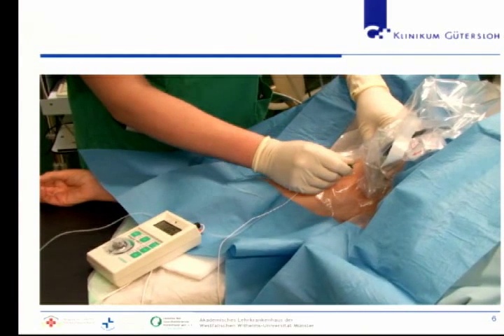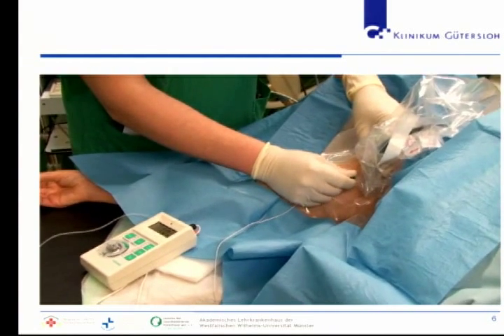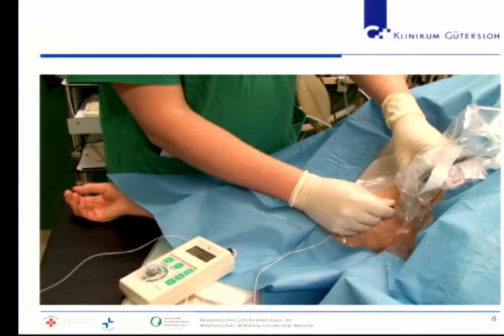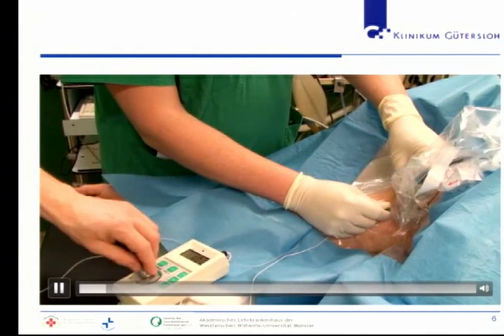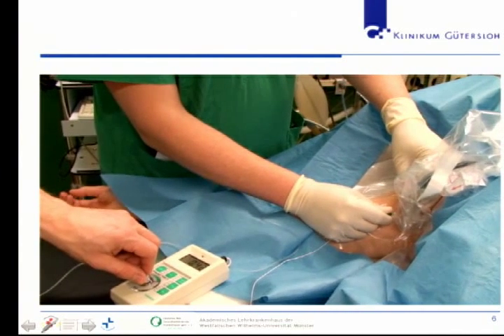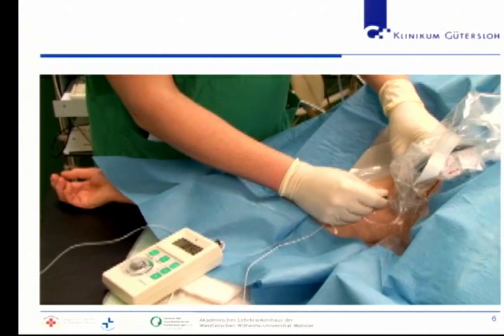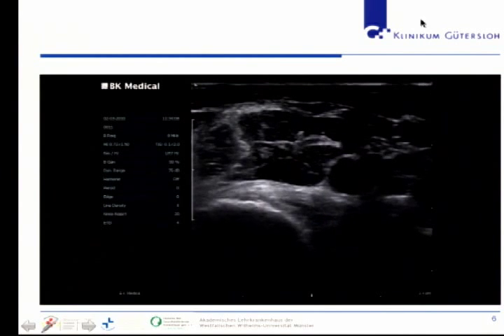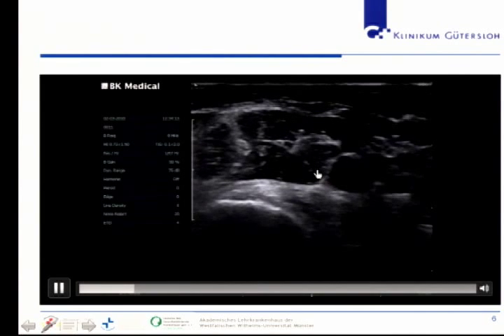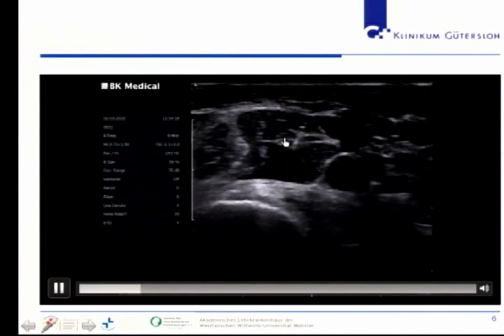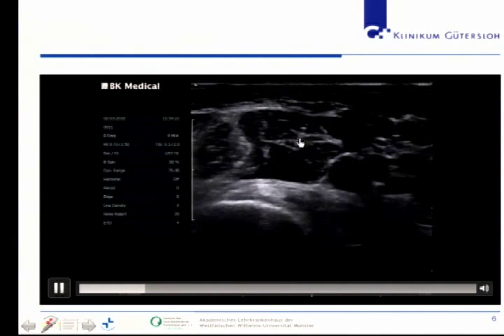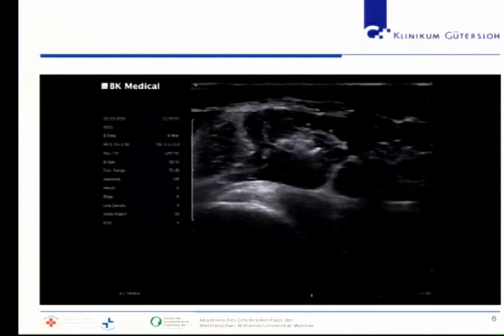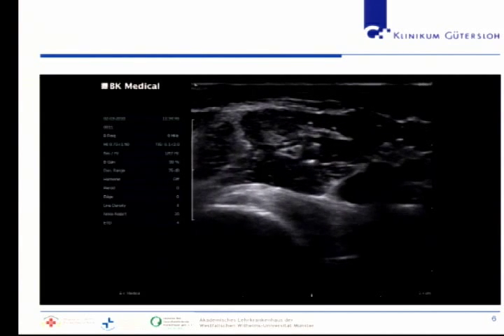You can see the ultrasound system being used with the needle. I am stimulating with one milliamp and reducing the signal. With reduced energy, we get less motor response and less reaction. We have a short-axis approach to the musculocutaneous nerve. The application is visible, but the needle is relatively close, and we are not perfectly sure the needle is not coming too close to the nerve. Once injection begins, the motor response disappears — that is one of the biggest problems with this technique.